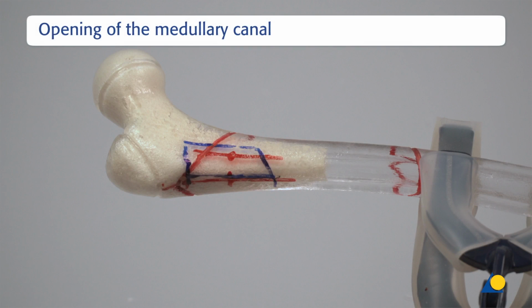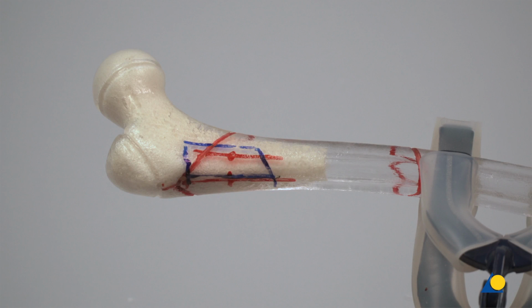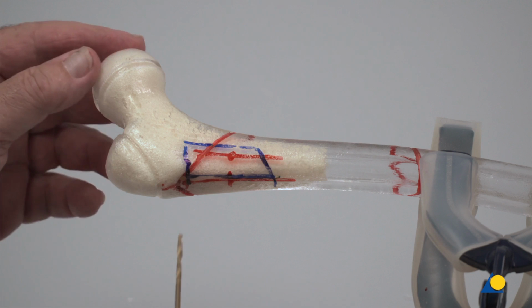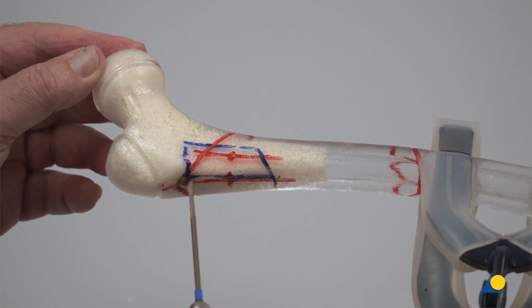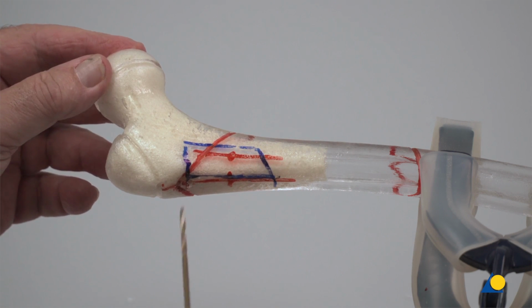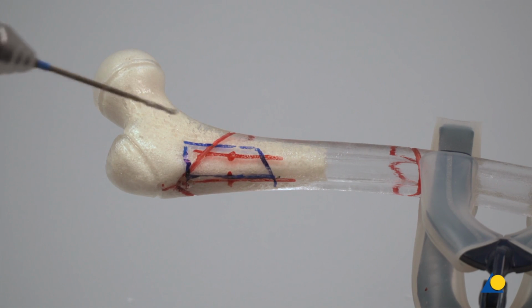As the bone model has a hard cortex structure, there is a high risk of slipping off the surface of the cortex, causing personal injury. Care must be taken when creating the opening. The cortex is opened using a 2.5 mm drill bit, directed 90 degrees to the bone at the surgical landmark.